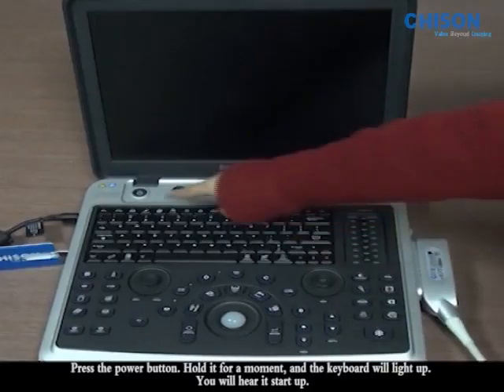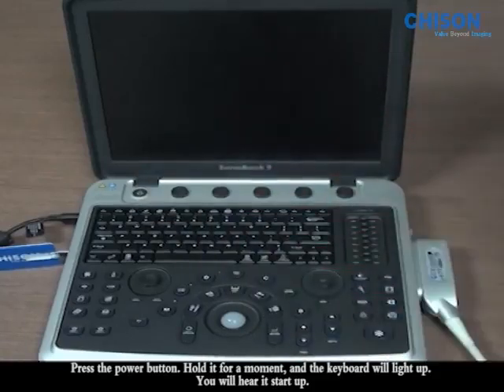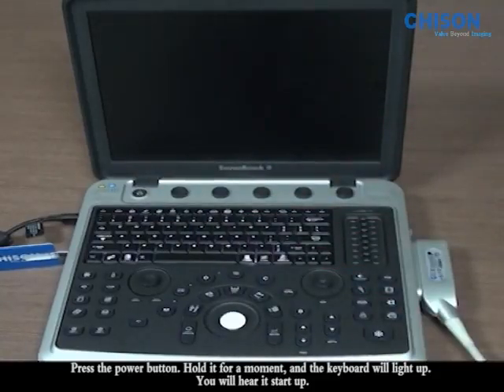Press the power button here, hold it for a moment, and the keyboard will light up. You will hear it start up.